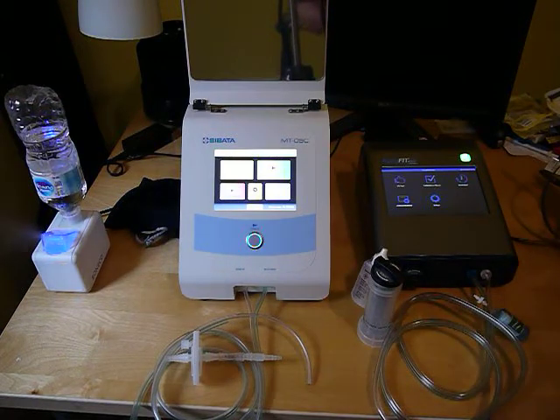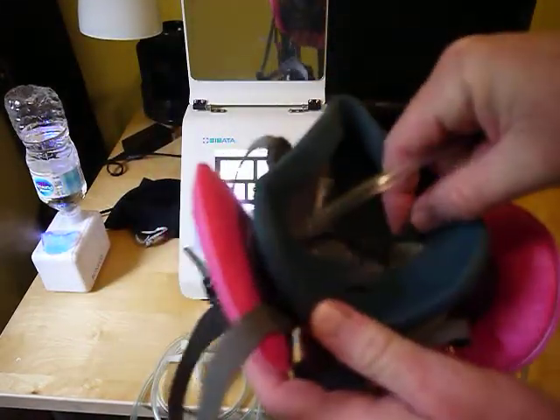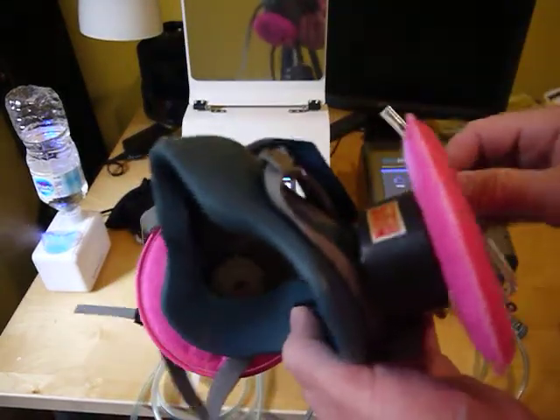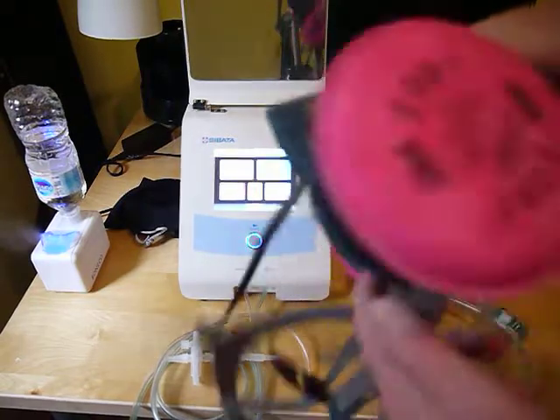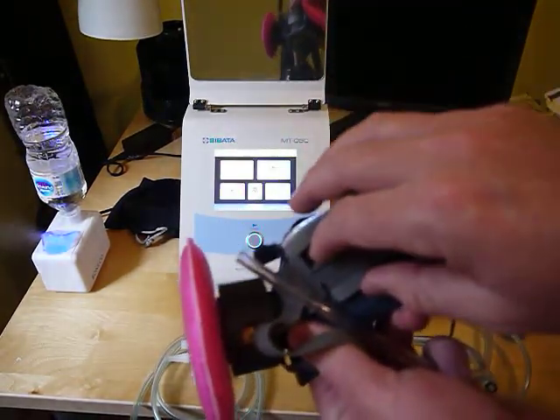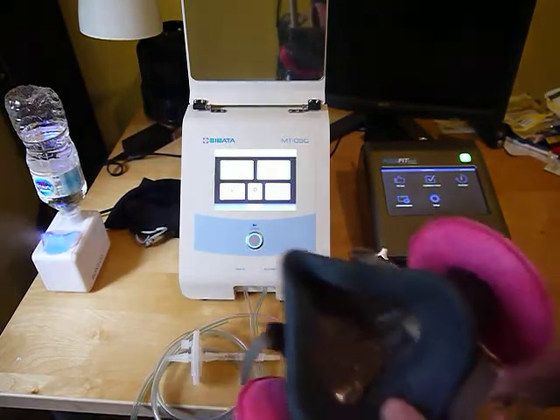When you're testing someone, make sure they're clean shaven and haven't smoked, vaped, or even eaten or drunk anything within the last half hour — anything they may breathe out that could cause particles to show up. All we're really doing is measuring the particles in the air with this tube, then this other tube measures particles inside the mask through this little tube coming through the valve. If the person smoked recently, they could be breathing out particles that the machine interprets as a leak.